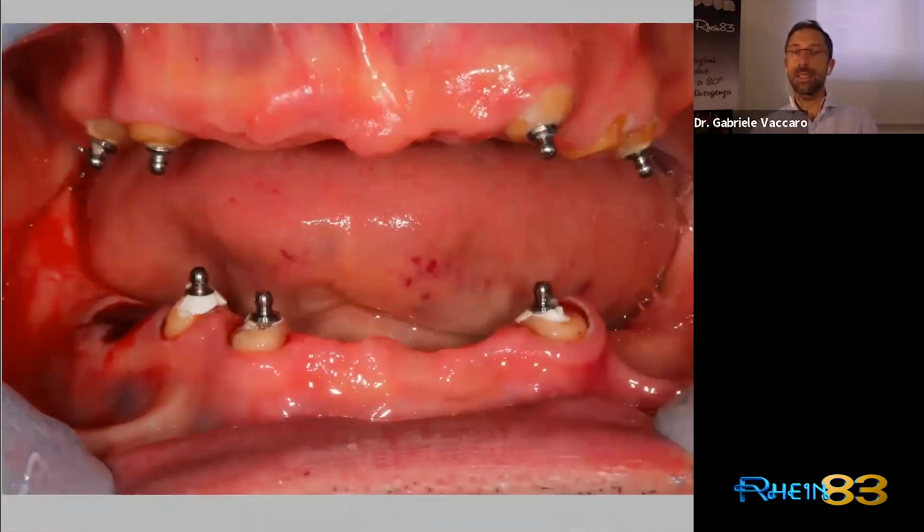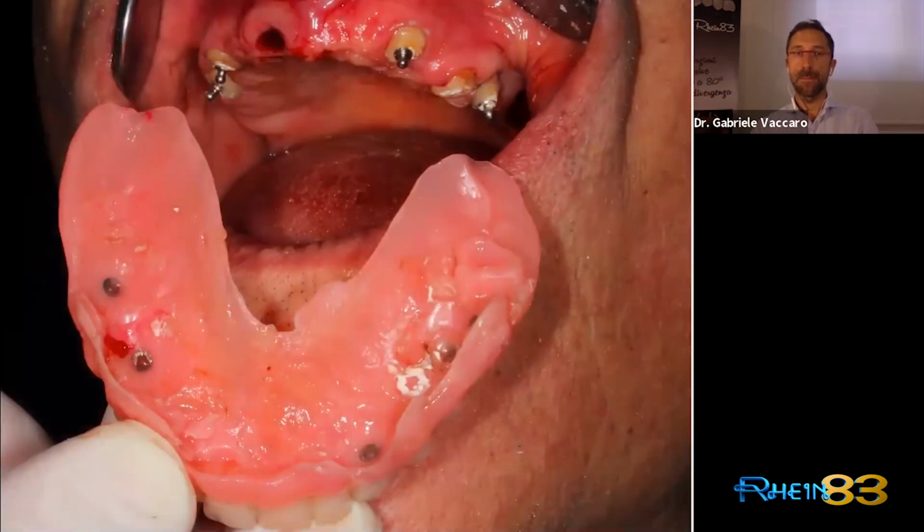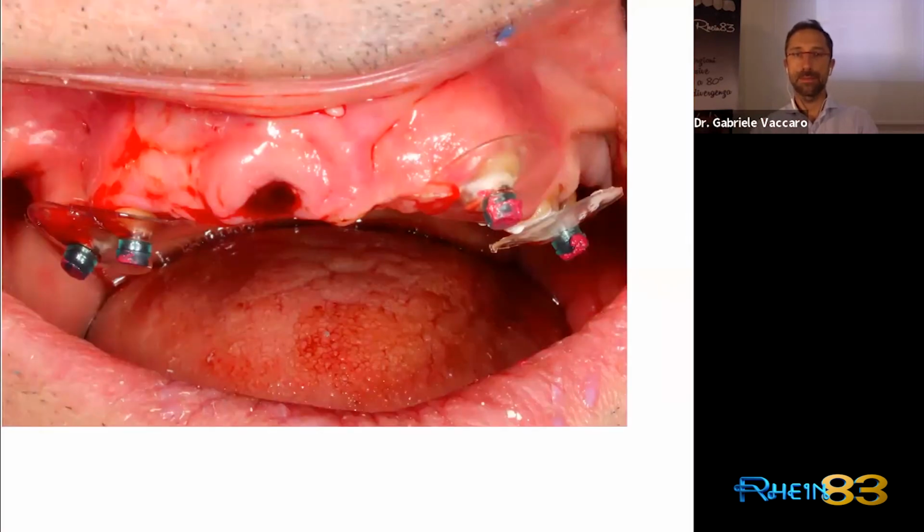After that, I remember, this is the temporary prosthesis. I want to remember this. Okay, I reline the same way as the upper part. So, protection disc, female cap. This is the day of the extraction.